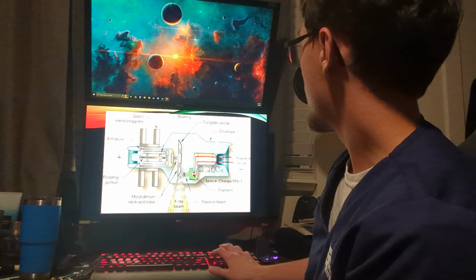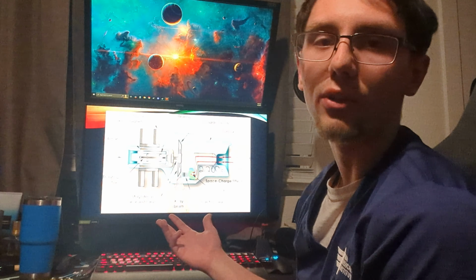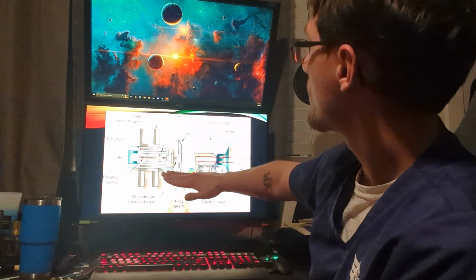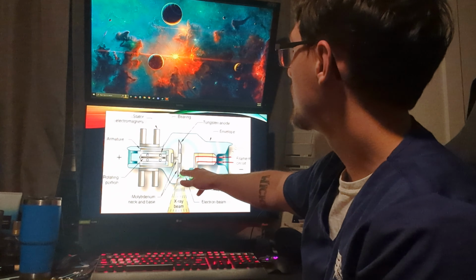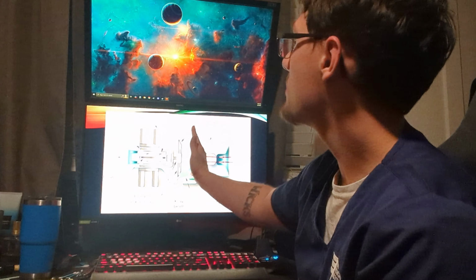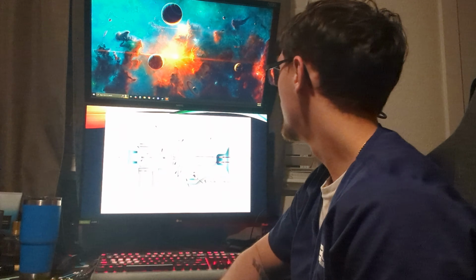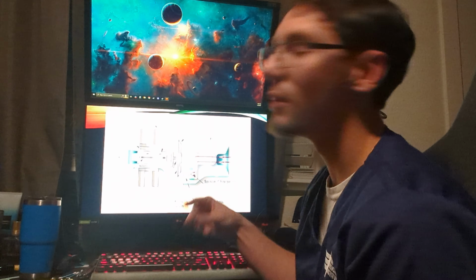So once you get the desired amount of electrons over there, like for example, if for this scan we'll say you needed 1,000 electrons. Once there's 1,000 electrons built up there, they will send over to the anode side, at which point they will bounce off the anode disc here and become X-rays. But if nothing were to be happening on the left side here, these electrons would immediately burn through that disc. They're so high energy and so high speed that even the highly heat resistant tungsten would be burned through in an instant.